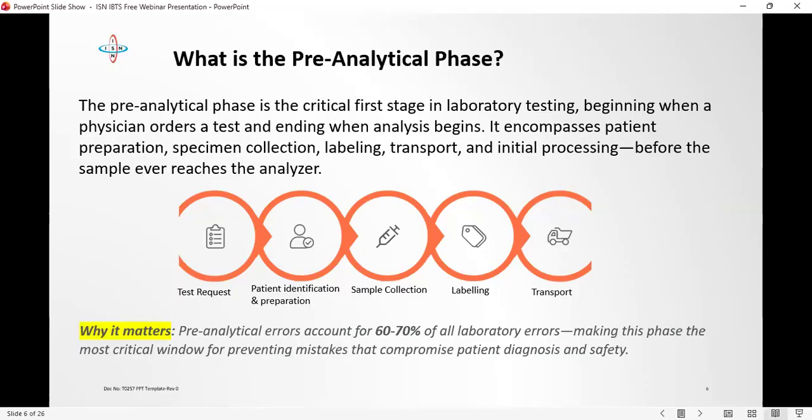So when you get a result like that, 7.0 for potassium, someone that is not conscious about good laboratory practice, as long as the analyzer does not flag any error, they want to release the result. But a good laboratory practice professional will stop at that point and ask questions. Was the sample hemolyzed when it came into the lab? Was there prolonged tourniquet application? Was the sample shaken vigorously, maybe while moving from the phlebotomy unit to the laboratory? Was there any vigorous mixing of the sample? Was there delay before centrifugation?